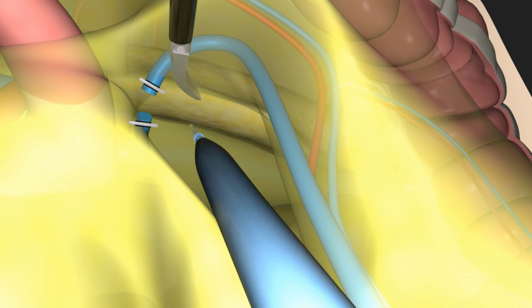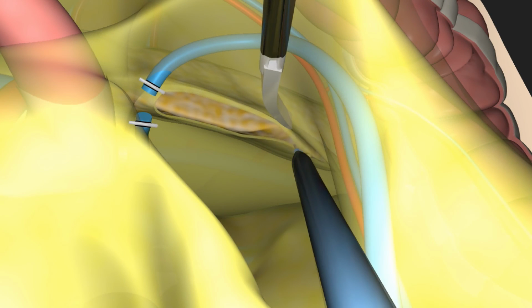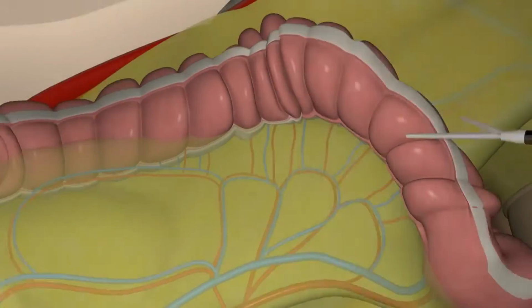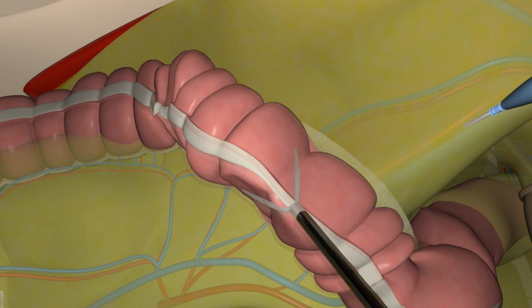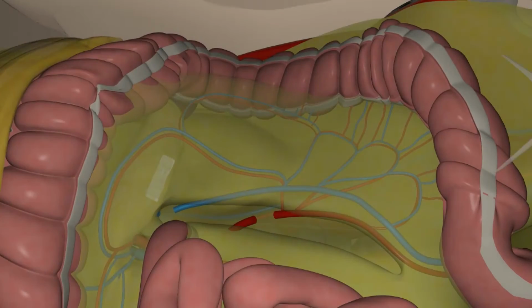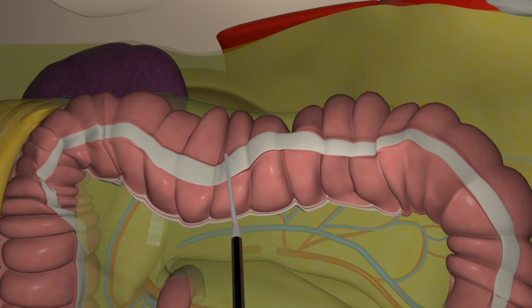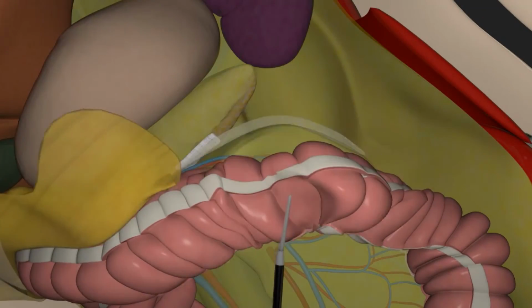The sigmoid colon is then completely free and the lateral attachments can then be divided using a lateral approach. Medial traction allows the lateral attachment of the sigmoid colon to be seen and divided using cautery. Bruising from the retroperitoneal mobilization of the colon can usually be seen in this area. Once the layer of the peritoneum has been opened, one immediately enters into the space opened by the retroperitoneal dissection. Dissection now continues up toward the splenic flexure. Splenic flexure mobilization is essential for a tension-free anastomosis.